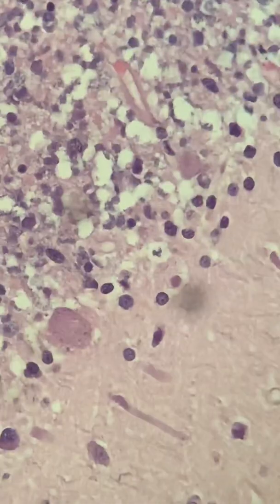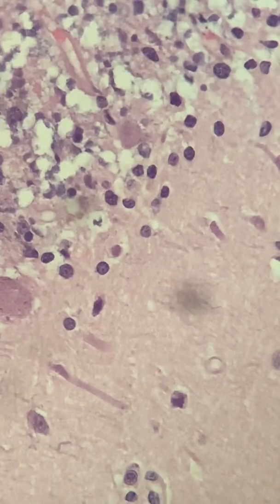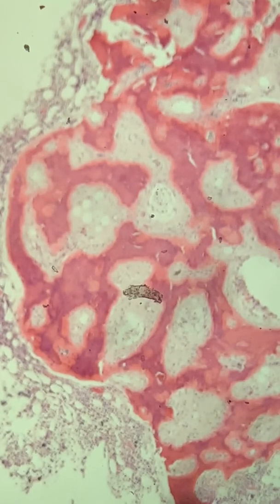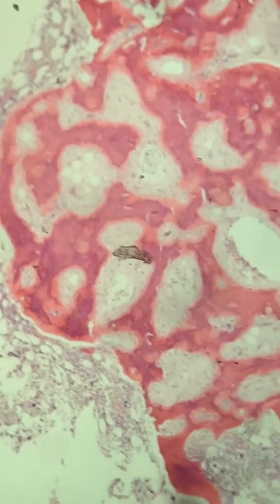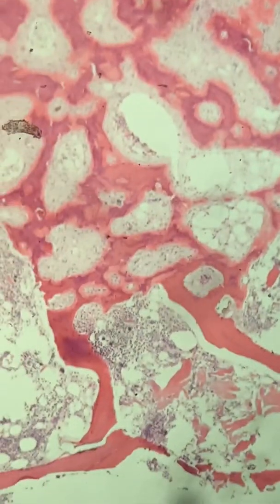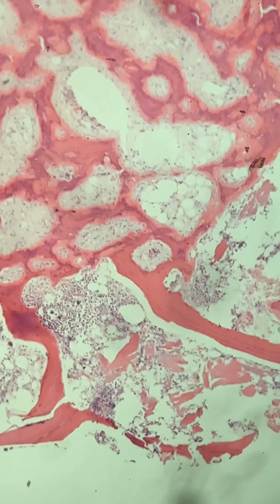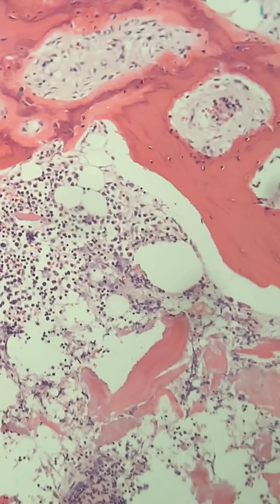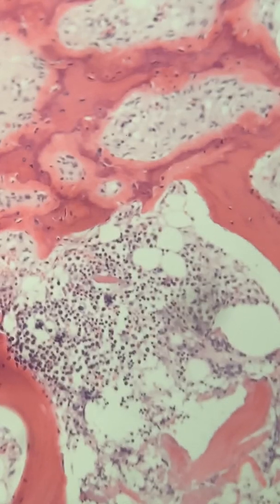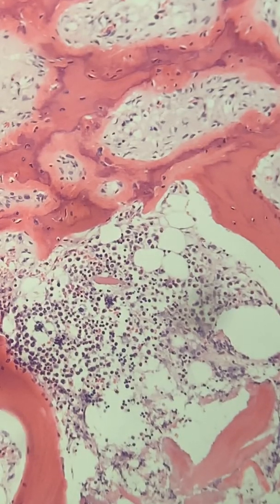All right. So now I'm going to go to the bone marrow. Now, most pathologists don't even sample marrow tissue for autopsy. I do. So you get some cortical bone here, and then you see the medullary bone, and you see the marrow elements in between the medullary bone, the bony spicules, the trabeculae. And then we go down, you can see that's nice cellular marrow, normal cellular marrow, about 40% cellularity.